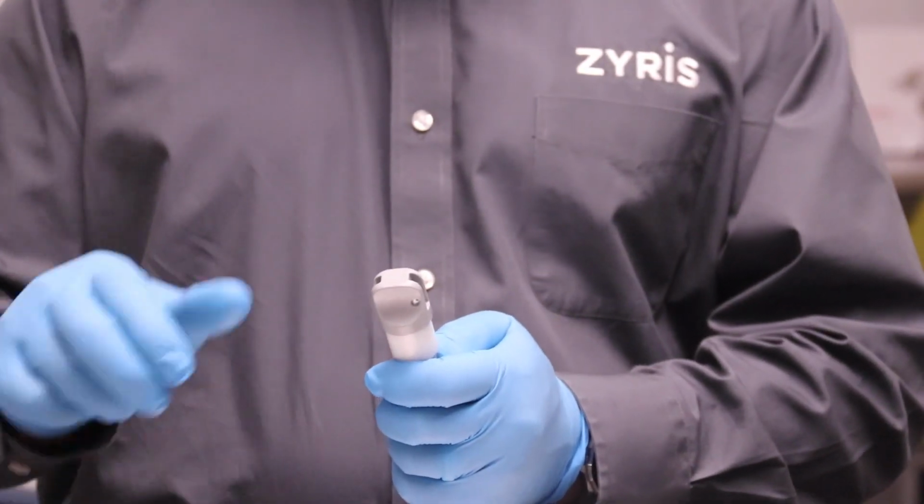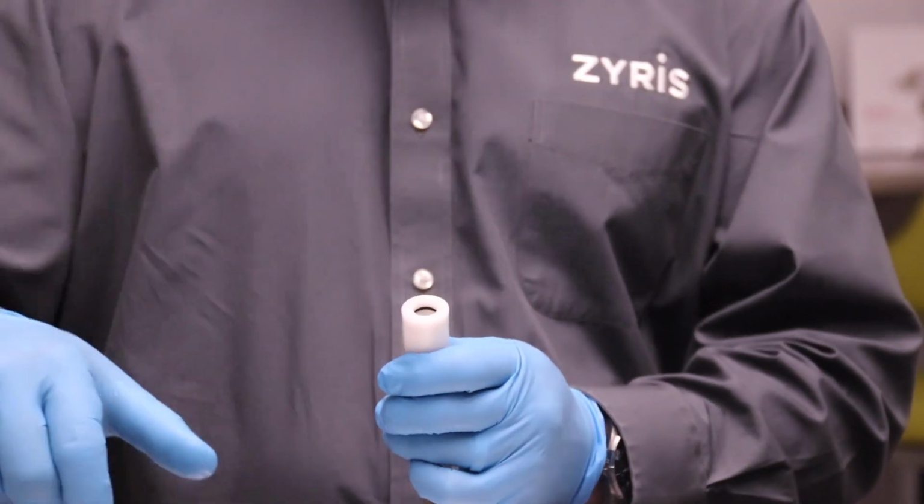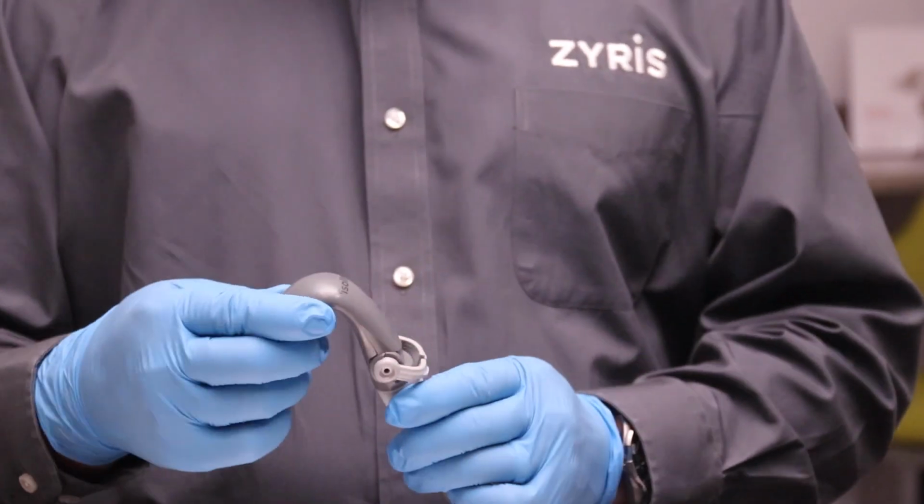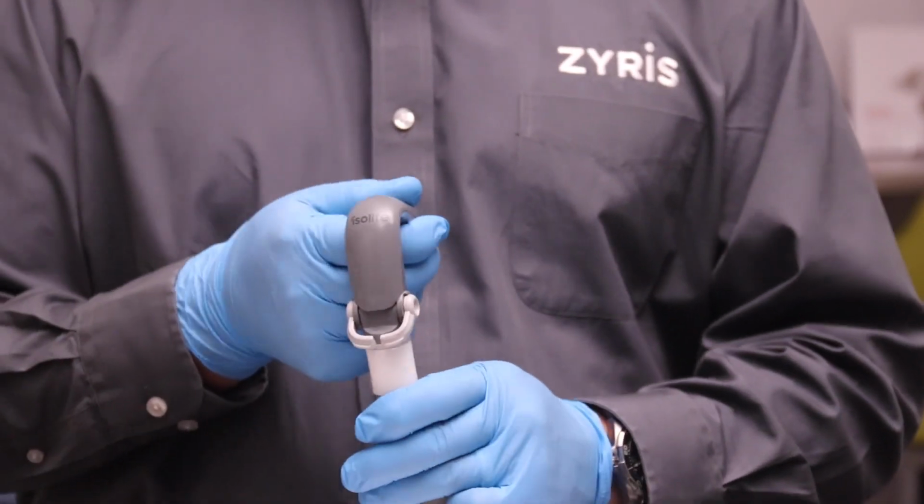Pull the line plug off of the HVE hose and then simply place your Isolite core posterior control head onto the hose and you're ready to go.